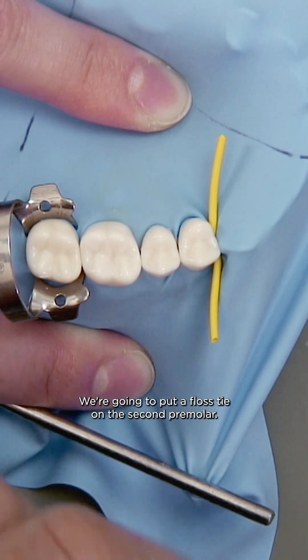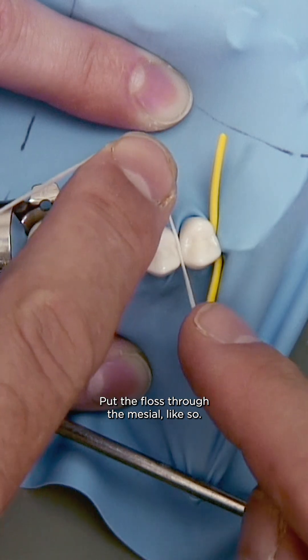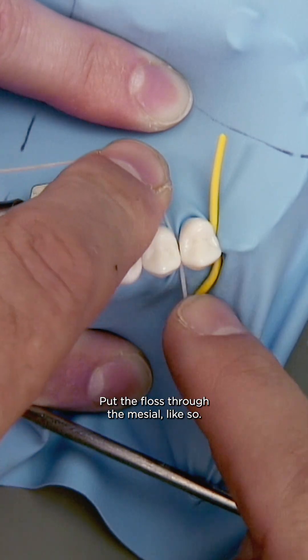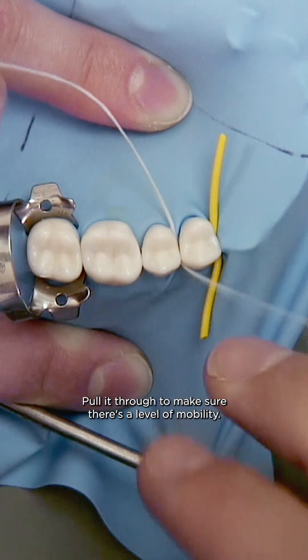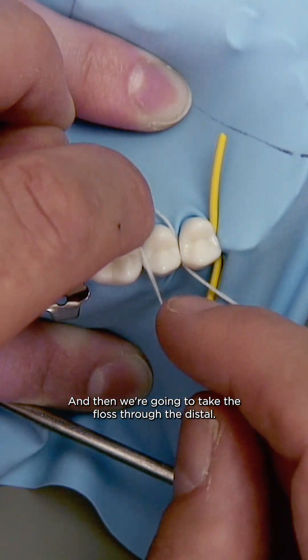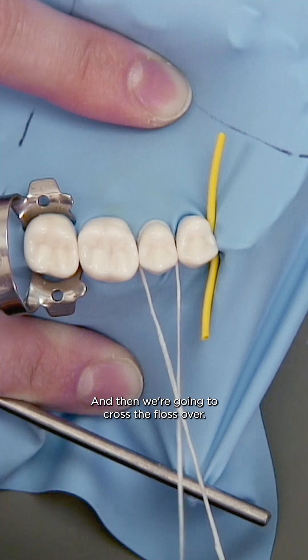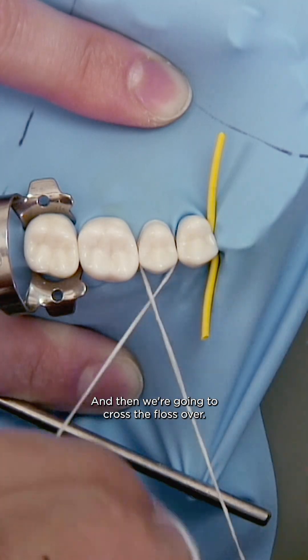We're going to put a floss tie on the second premolar — put the floss through the mesial like so, pull it through to make sure there's a level of mobility, and then we're going to take the floss through the distal and pull that through and then cross the floss over.